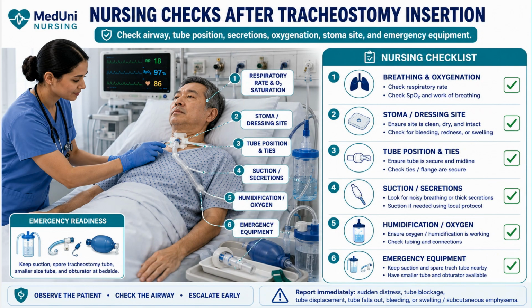With a tracheostomy patient, start with breathing. Ask yourself, is the patient comfortable or distressed? Is the oxygen saturation dropping? Is there noisy breathing or increased work of breathing? Check air entry, respiratory rate, and oxygen delivery.